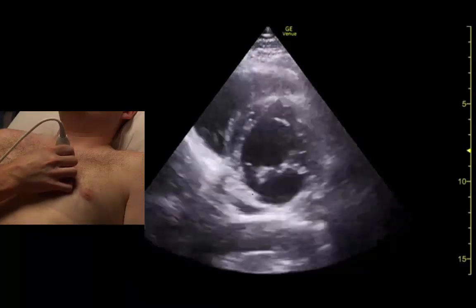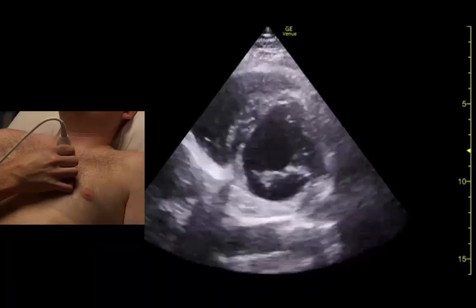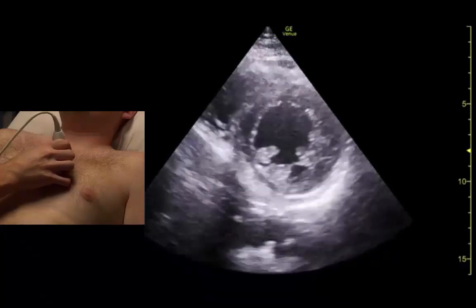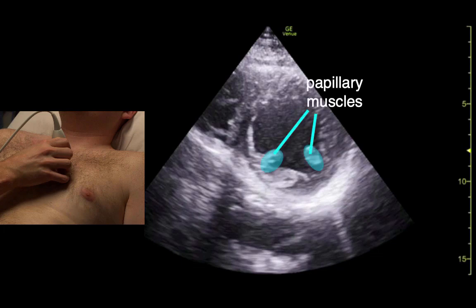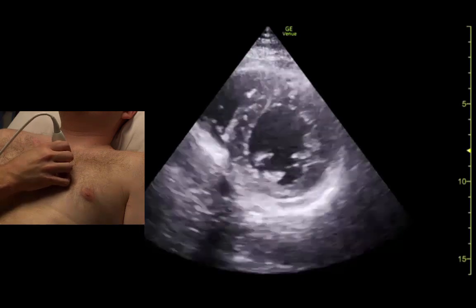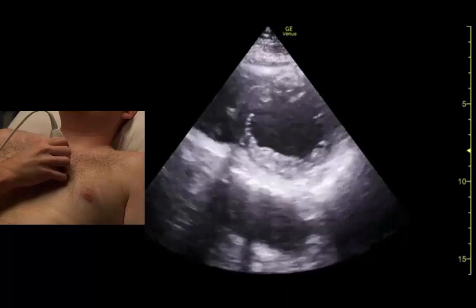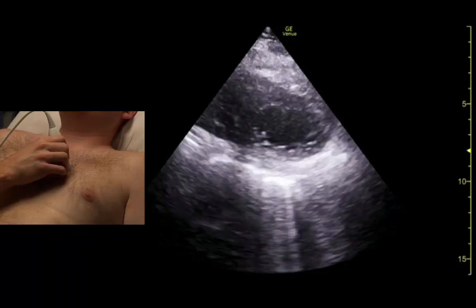As we fan away we get the mitral valve in cross-section — the fish mouth view. A little further out is the mid-ventricle where we see the papillary muscles, and we may go out even further to see the ventricular apex.